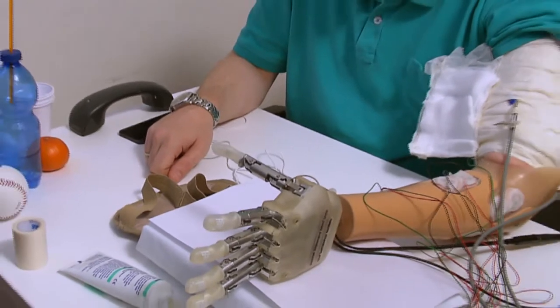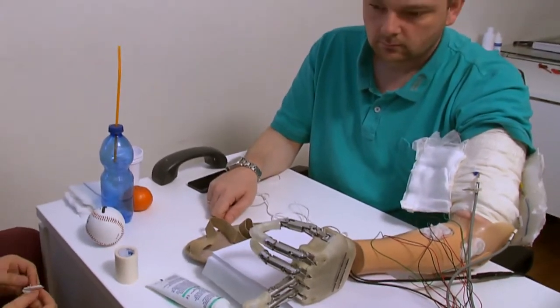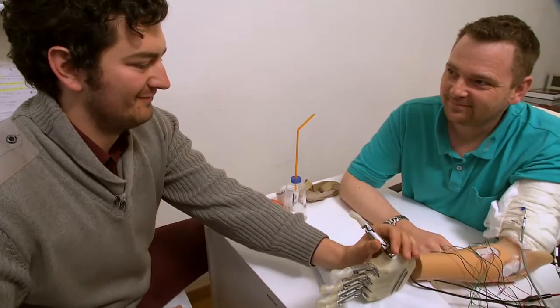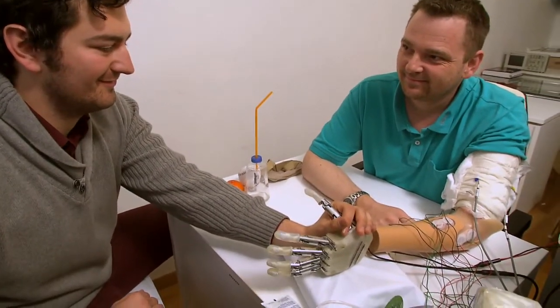For the first time, we were able to restore a real-time sensory feeling in an amputee while he was controlling this sensorized hand. It was quite amazing because suddenly I could feel something that I haven't been feeling for nine years.